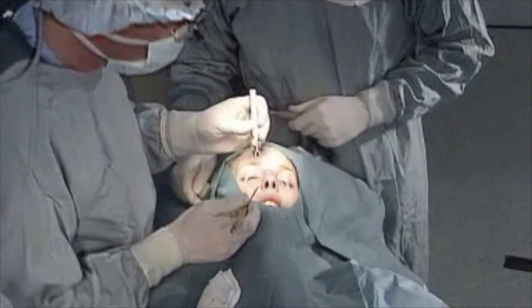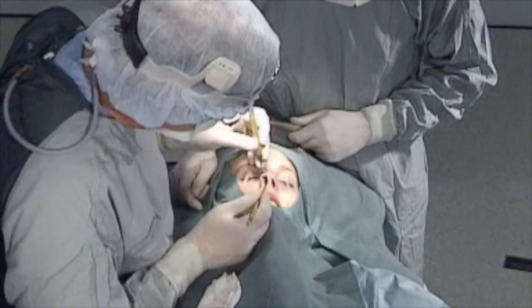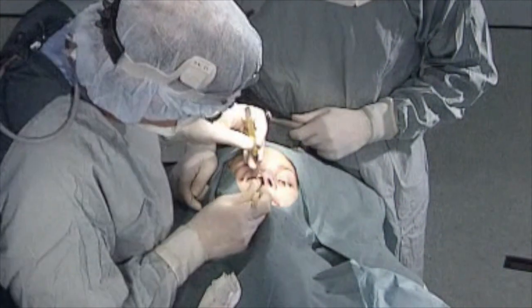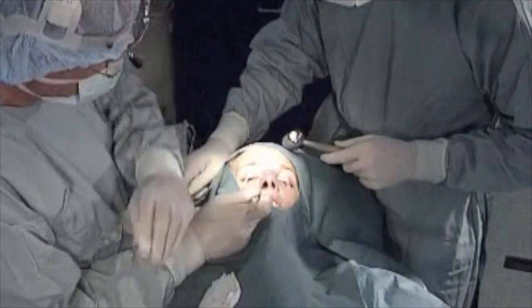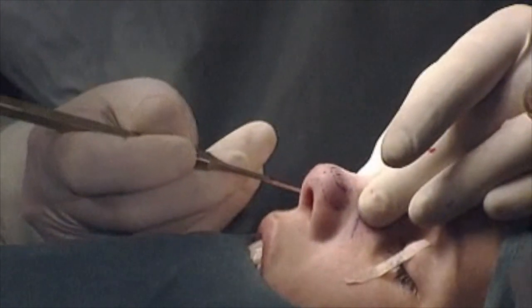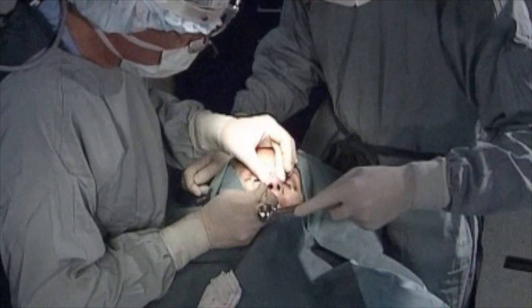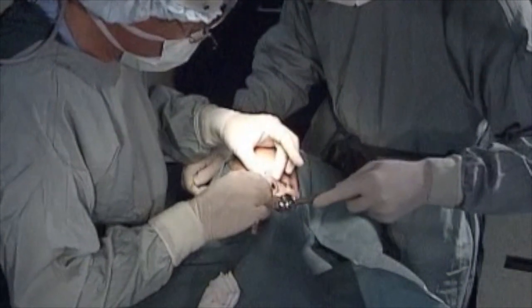Now we perform at the right side our lateral osteotomy endonasally, just on the piriform aperture at the site of the attachment of the inferior turbinate. We try to find the right position, just first downward to leave a little triangle. Yes, tip tip. Okay, then we take over in another direction.